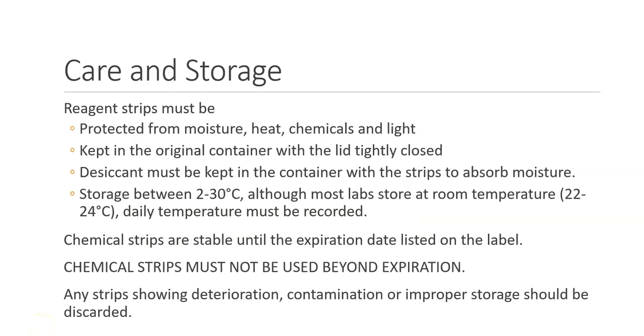It is imperative that you follow the manufacturer's instructions for the care and storage of these reagent strips. They must be protected from moisture, heat, chemicals, and light. So if you have a window in your laboratory, do not put those strips in the window. The heat can cause the chemicals to deteriorate or change to where inaccurate results would be obtained. You have to keep the strips in their original container with the lid tightly closed to prevent moisture from getting inside. The desiccant must be kept in the container with the strips to absorb the moisture.